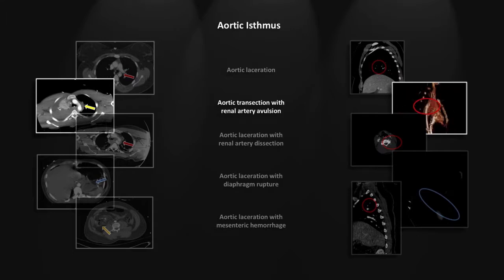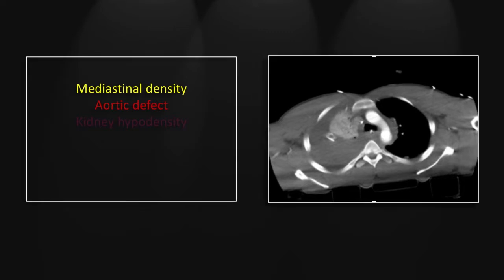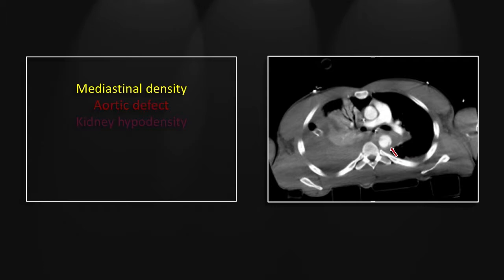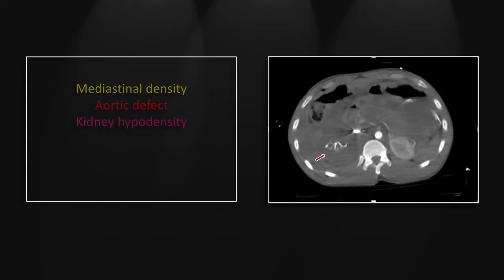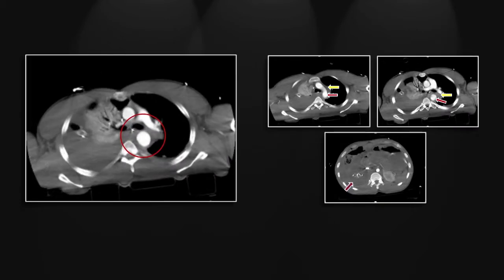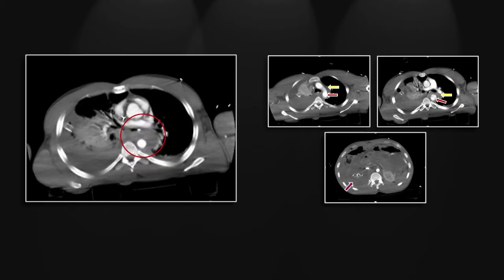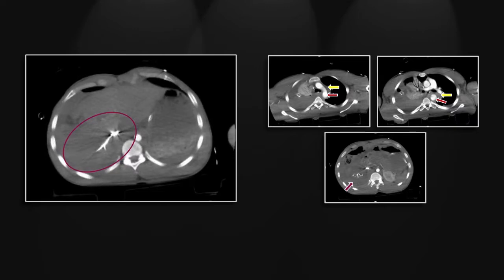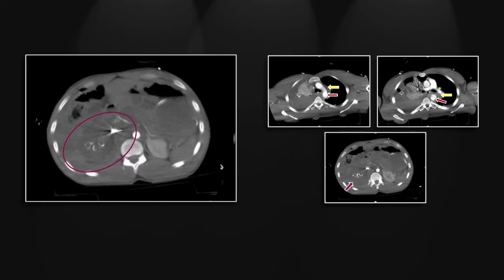Our next case is an aortic transection with avulsion of the right renal artery. In these transections, there will be both proximal and distal aortic defects visualized as the torn portions of the aorta pull apart. Here we see mediastinal fluid and the proximal aortic defect, and lower down mediastinal fluid and the distal aortic defect. This patient also has a markedly hypodense right kidney. You can see the asymmetry compared to the left nephrogram, clearly indicating that this kidney has lost arterial flow. The central serpiginous densities in the right kidney are right renal venous back flow. Here are the proximal and distal defects in the aorta with an intervening segment of dilation bound by adventitia, and here is venous back flow first in the adrenal vein and now in the renal vein.